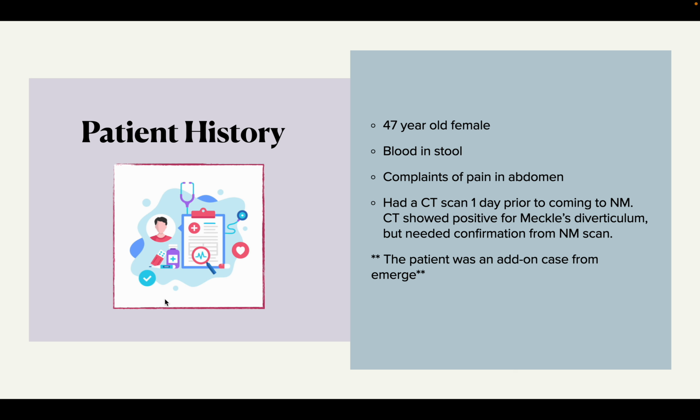Also, something weird about this case was that it was an add-on case from the emergency room. A Meckel scan, I would say, typically isn't from Emerge, but this one was, so that was already kind of odd about this case.